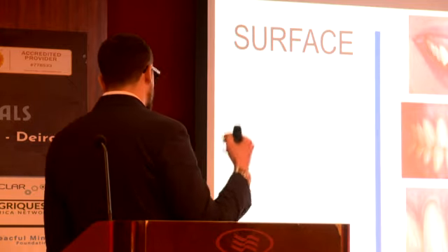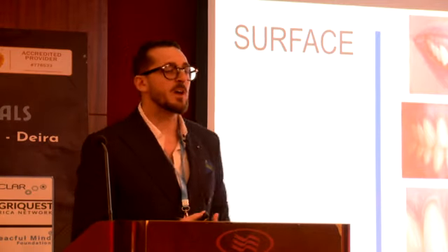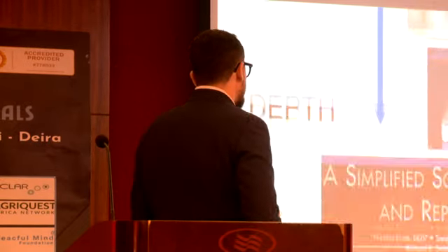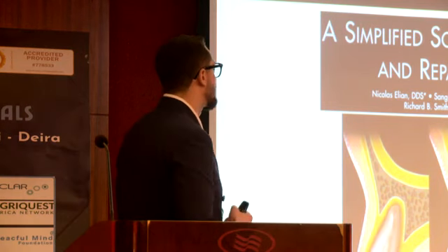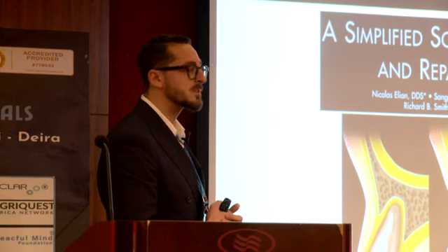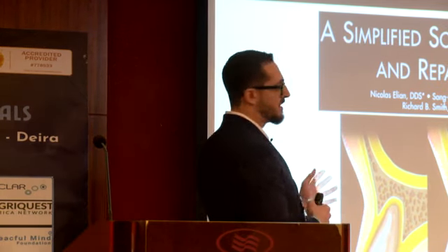And finally, the last layer: you have to take a look at the CBCT or any X-ray in order to plan our treatment. So when having a case of immediate implant, we should start by also analyzing the bone, the hard tissues. We have a classification from Elian about the kind of extraction socket.